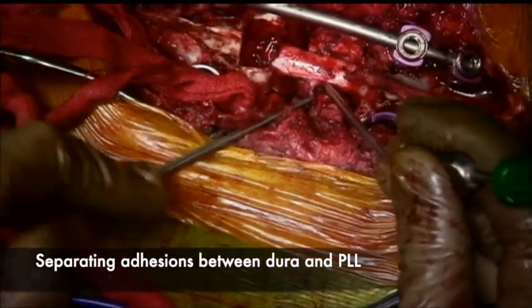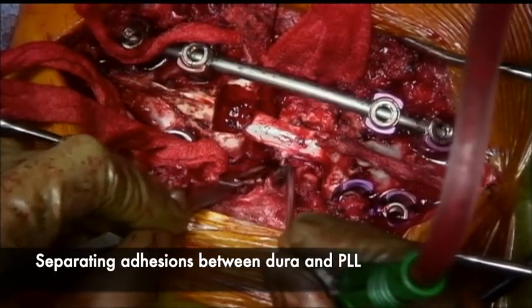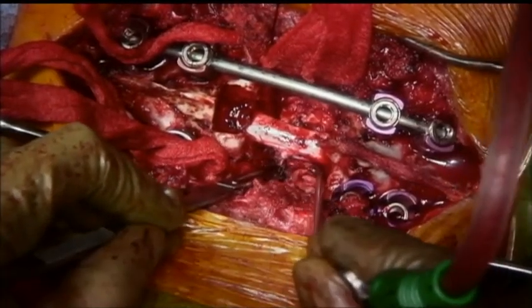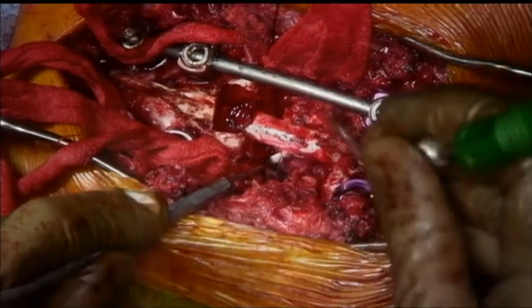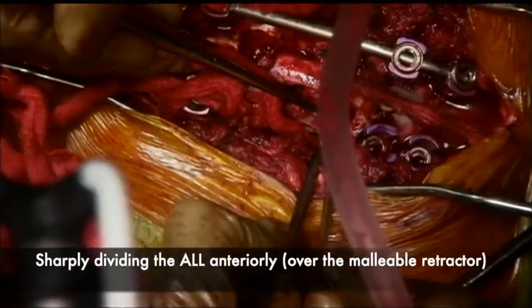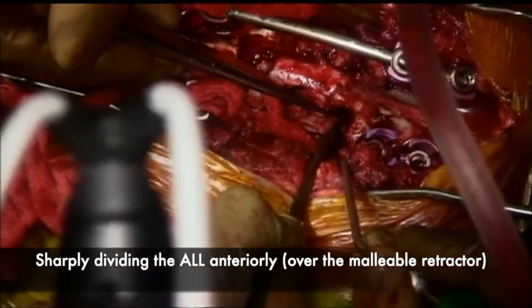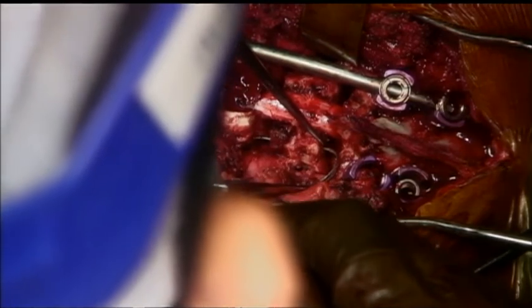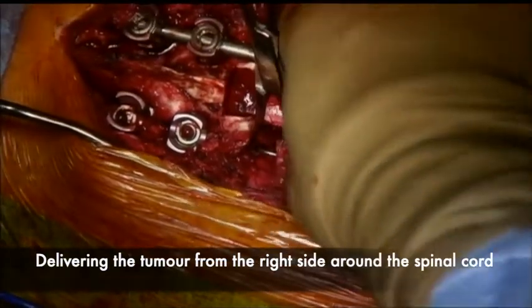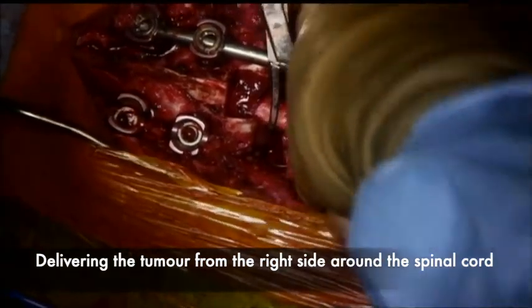There are some adhesions between the dura and the posterior longitudinal ligament. These are carefully dissected and separated, ensuring the dura is free from all adhesions. The anterior longitudinal ligament is then sharply divided with a number 15 knife over the malleable retractor. Only after this can the vertebral body be swung out from the right side. When reasonably free from all attachments, it is grabbed with a towel clip and gradually rotated around the spinal cord, delivered out from the right side.